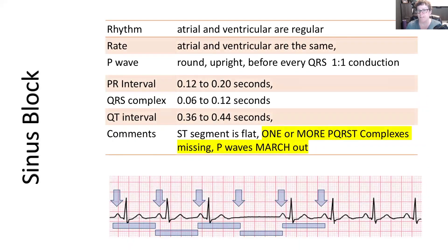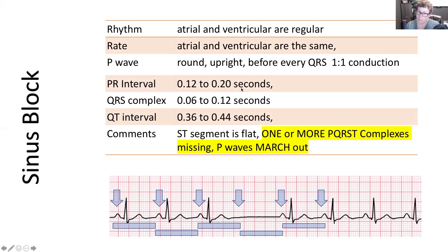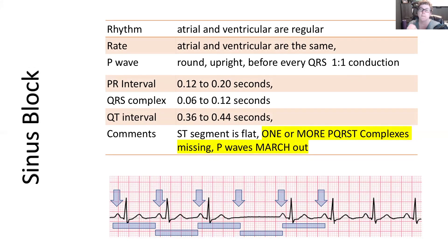When we come to our parameters, everything is normal except that missing QRS complex. The rhythm is regular with one missing complex. The rate will be within 60 to 100. P waves are round and upright because the SA node is working — that's not the problem. PR interval is 0.12 to 0.20 seconds, QRS is 0.06 to 0.12 seconds, and QT is normal at 0.36 to 0.44 seconds. One or more PQRST complexes — the entire thing — is missing.